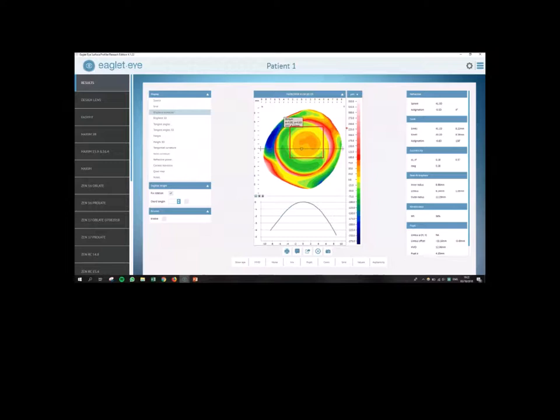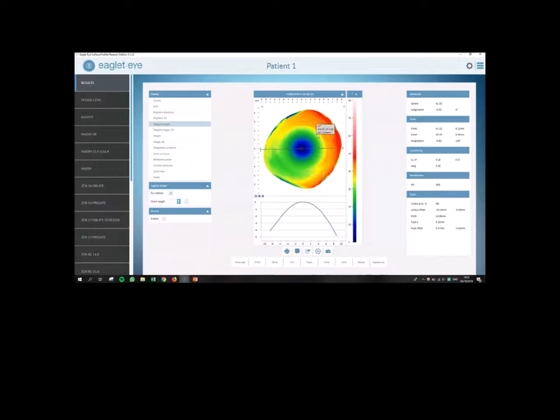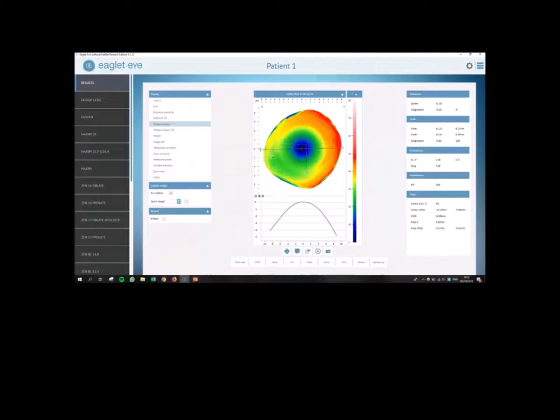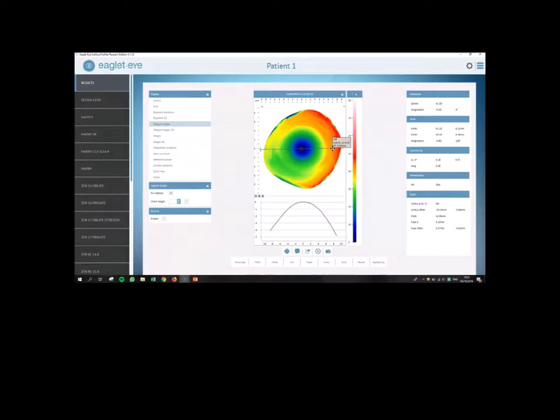But I wasn't going to talk about ortho-K. I was going to show you guys how you can see if an eye needs a quad specific lens. So in this case, I'm just going to move over to another map, which is the tangent angle map, which is showing you guys the tangent angle taken from the top. So if you look at this, you can notice a very large green area in this section, which means it's lower compared to the rest of it.